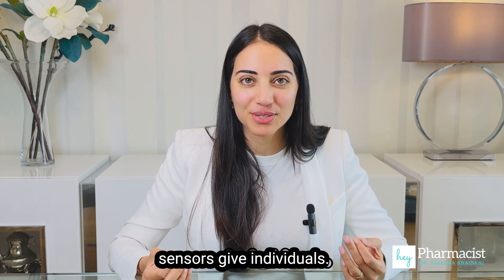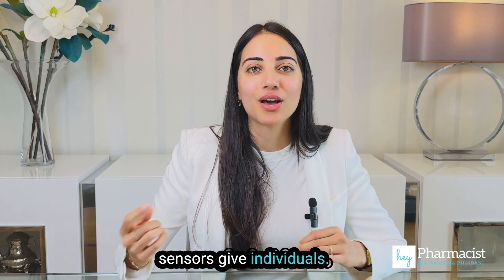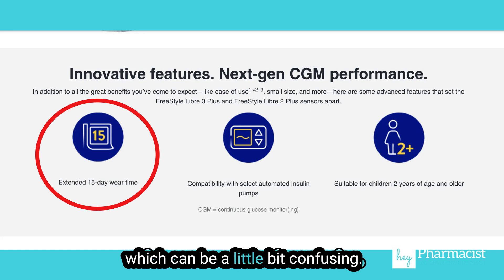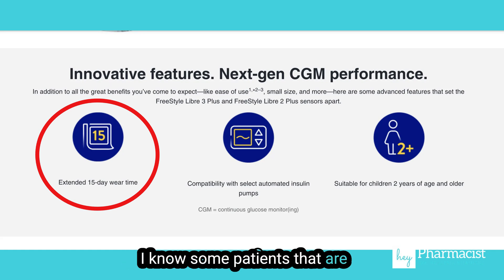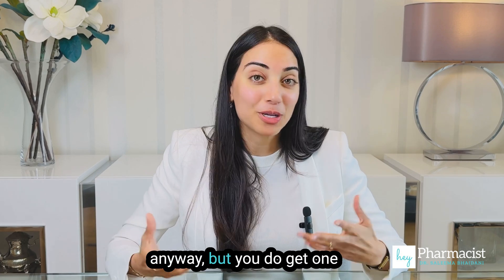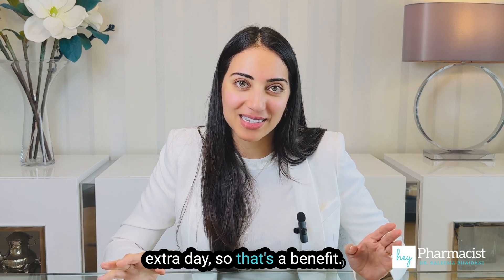First of all, these new sensors give individuals one more day — so from 14 days to 15 days. This can be a little bit confusing for patients who are really used to changing them on the same day, like every other Sunday. But you do get one extra day, so that's a benefit.